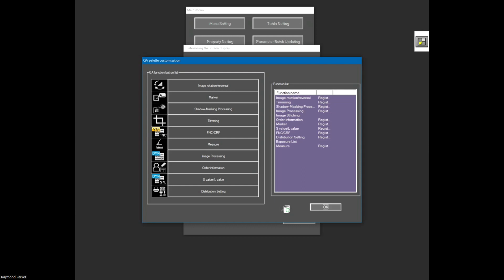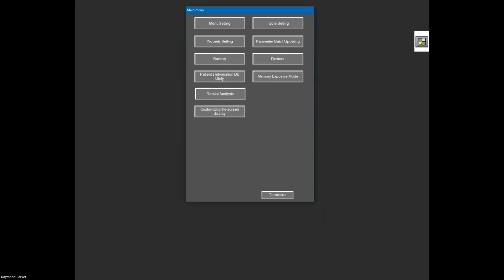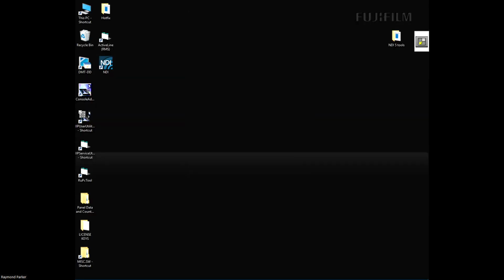It is not for diagnostic purposes. It can be sent to PACS, the image. It is not saved permanently on the FDX console software. You'll notice, though, considering my conversation earlier regarding the FNC being on for a general user, having access to that FNC function opens up their ability to use the virtual grid processing tool. Click OK. I'm going to click terminate and bring up the user FDX console.